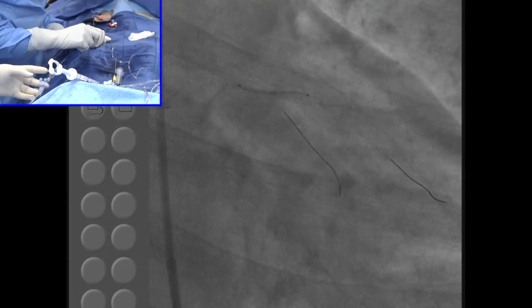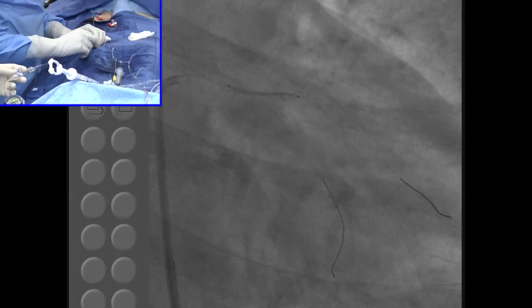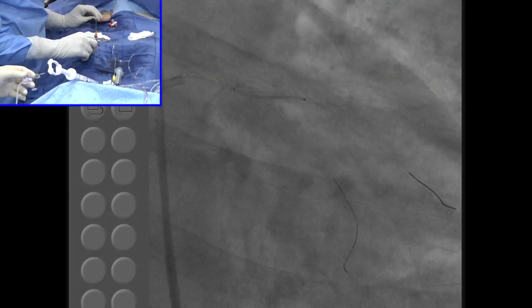The balloon again. You dilate that area. No, because we did not pre-dilate that area. That segment, yeah. Can you ask for a deep breath or no? Difficult.